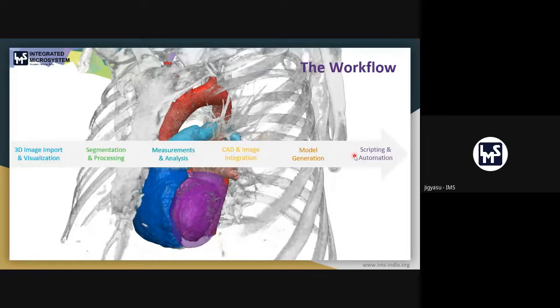Next step comes as scripting and automation. Once we have developed a workflow and we have multiple data sets on which we want to perform the same workflow, we have the option to generate scripts of the steps that we have done. So we can generate scripts in Python and C#, and we can rerun those scripts to complete all those tasks automatically. Other than that, we can generate some plugins. So let's discuss about these steps one by one.